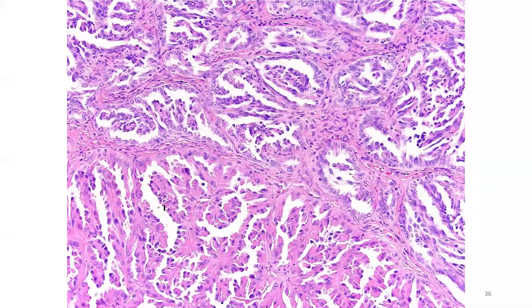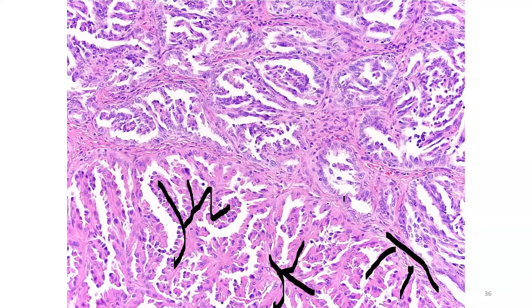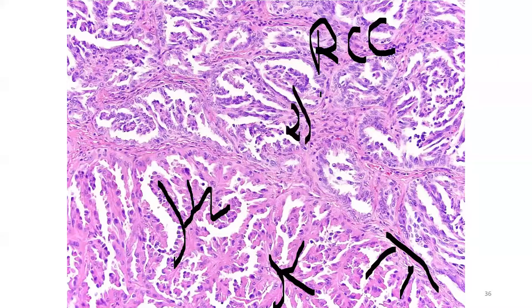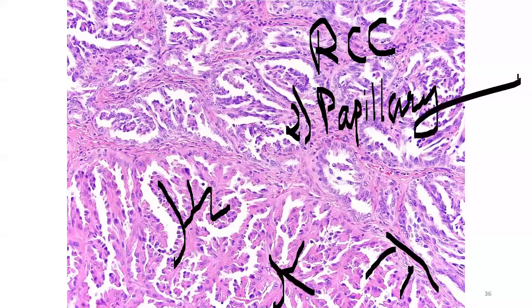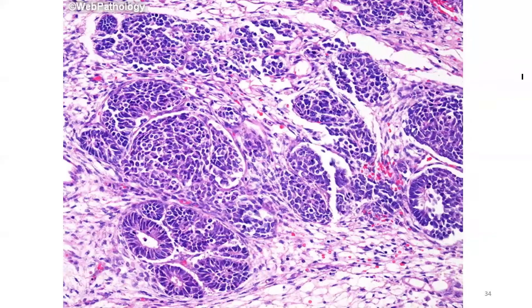This is another slide of renal cell carcinoma showing papillary formation — finger-like projections are visible. This is the papillary type of RCC, renal cell carcinoma.